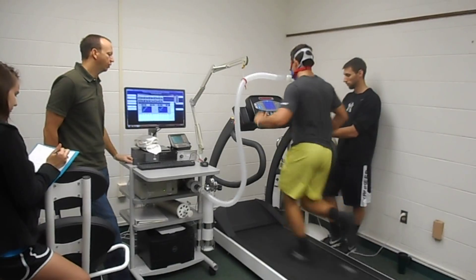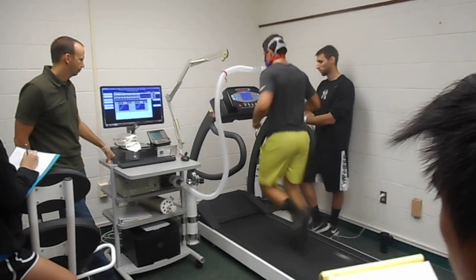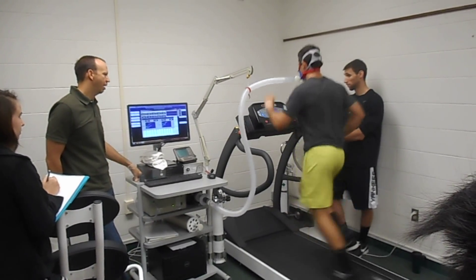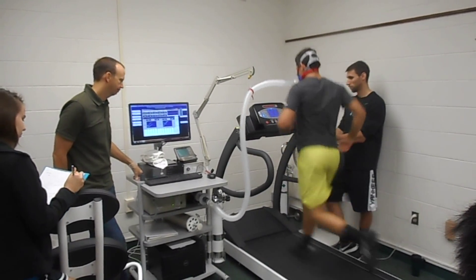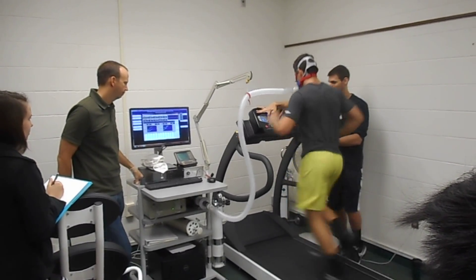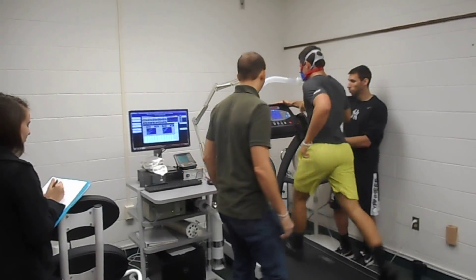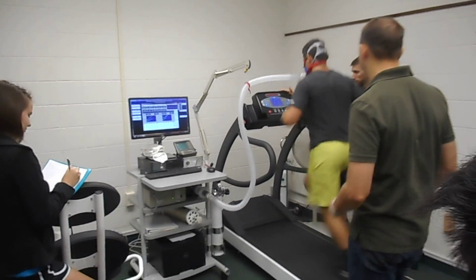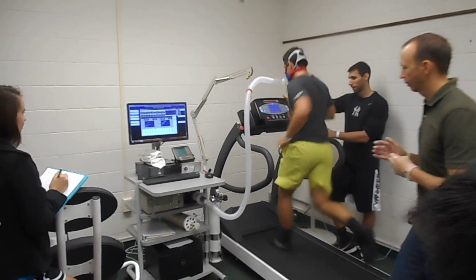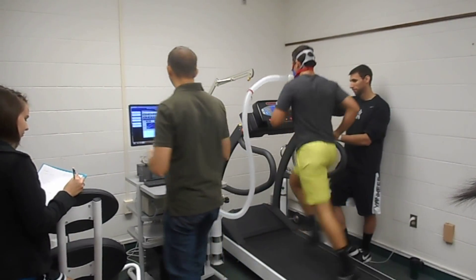The next increase is a grade increase — no speed increase. On a zero-to-ten scale, Zach's exertion is at five. Now comes the hill. VO2 is up to 38, RQ is at 1.02, and heart rate is getting really close to the expected maximum.